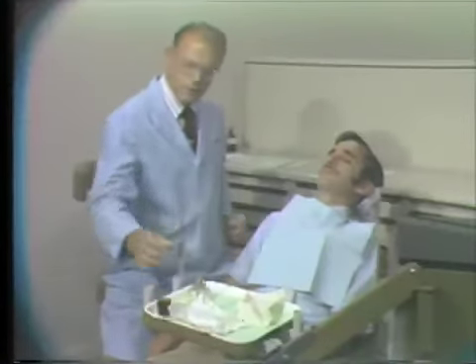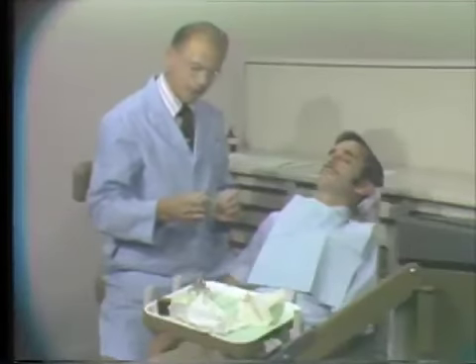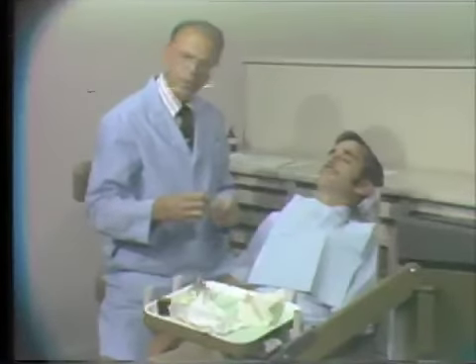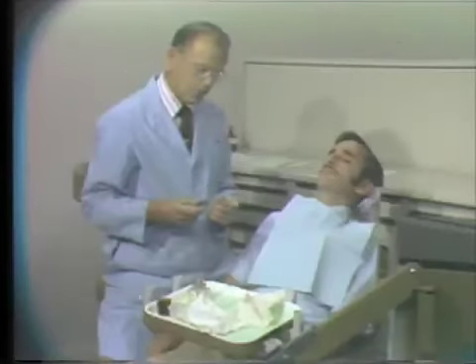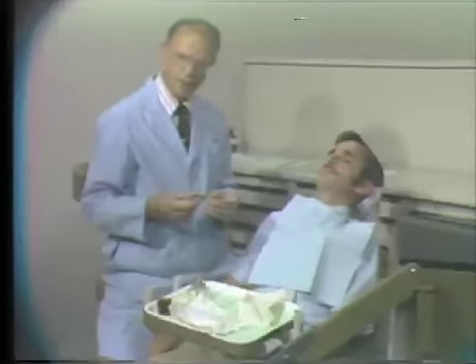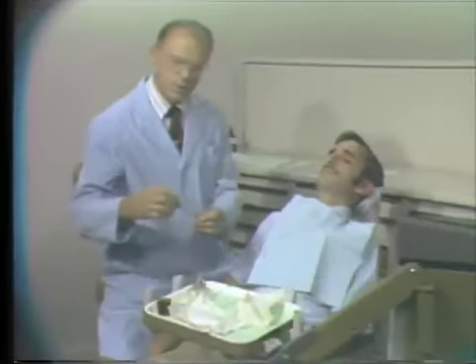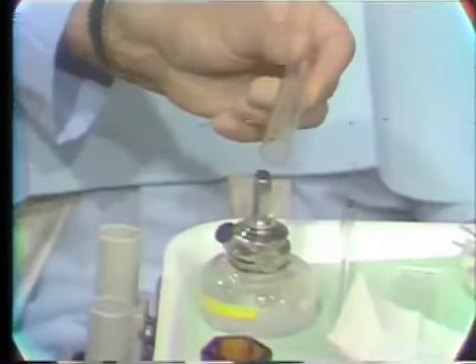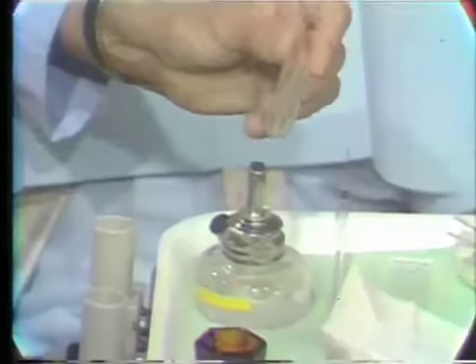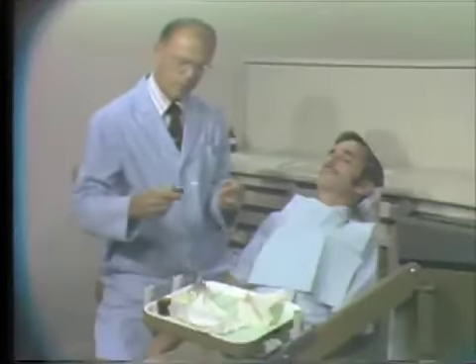Next, we will show the method of obtaining the specimen for smearing on culture media in the laboratory. To do this, we will use a cotton tip applicator that has been sterilized and placed in a glass tube. First, we will remove the cover and flame the opening to remove any possible bacteria that would contaminate our specimen.